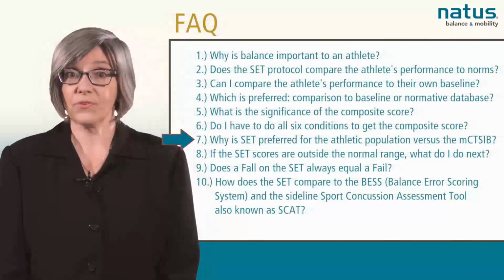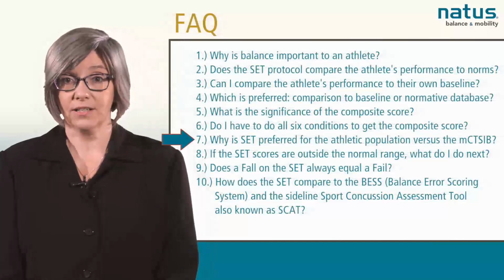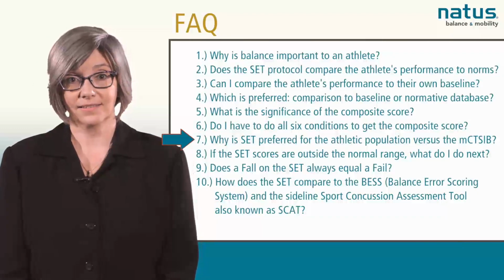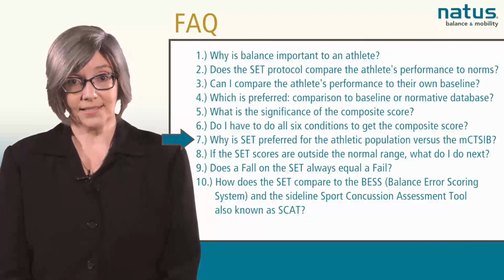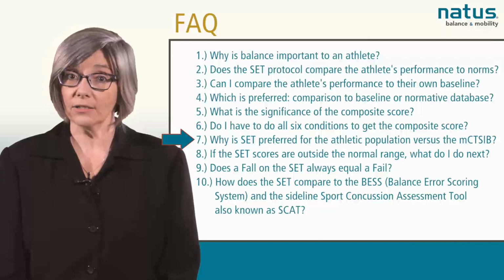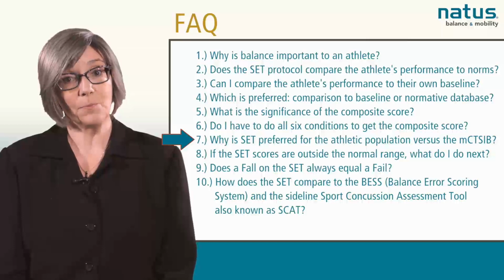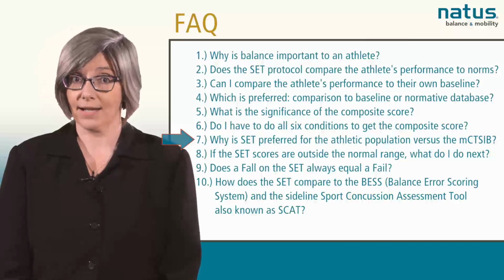Why is SET preferred for the athletic population versus the modified CTSIB? The modified CTSIB was developed originally for the elderly population and is not considered to present a sufficient balance challenge to an athletic population.